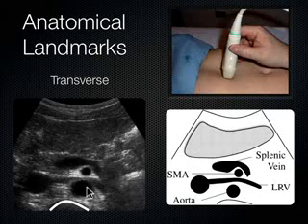Now, moving anteriorly, what vessel is this right here? It's bringing blood out to the intestines. It's a branch off the aorta. It's called the SMA, or superior mesenteric artery, and it looks like a mantle clock over here. Now, realize that you guys haven't had anatomy yet. I totally appreciate that, and I know I'm kind of getting the cart before the horse, but you're going to learn it eventually. You may as well get a taste of it. This is the mantle clock, this is the superior mesenteric artery, which I think looks like a mantle clock. Now, look at this anechoic structure crawling over the mantle clock.